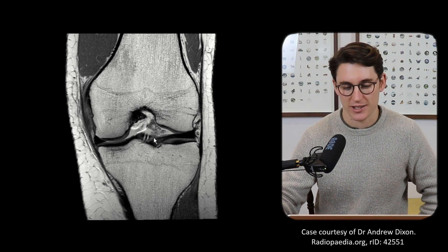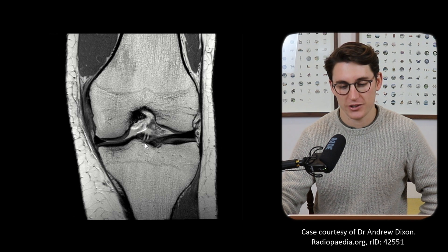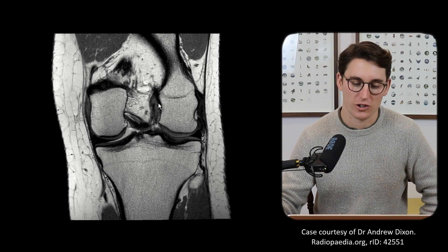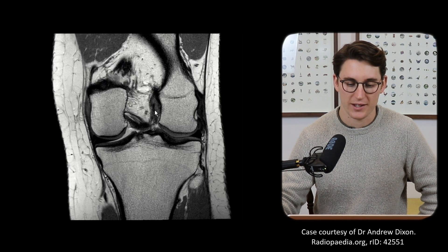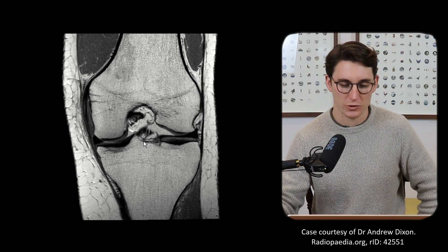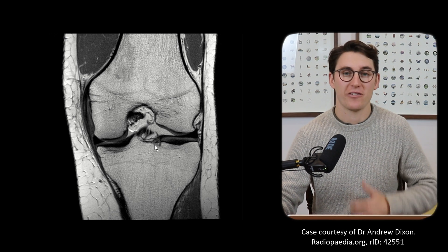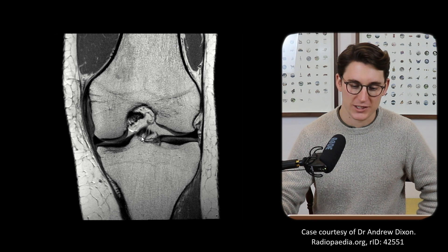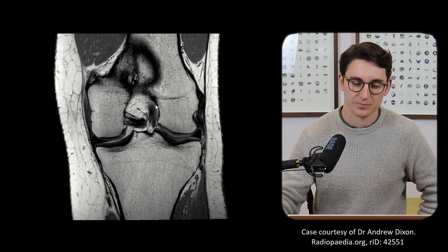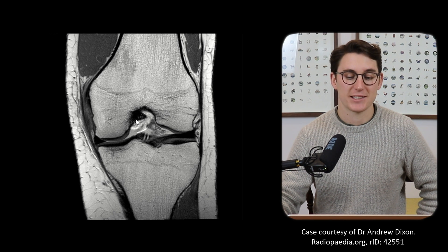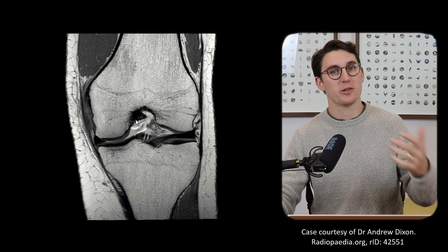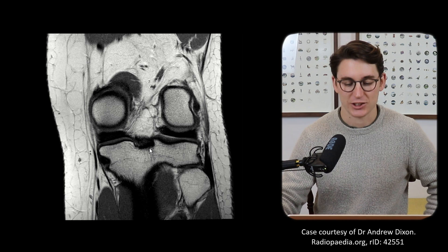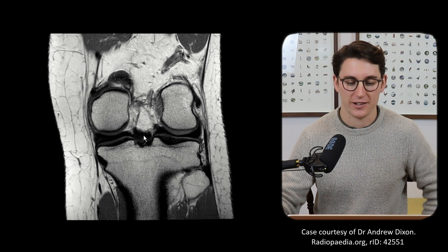Let's head into the joint itself. We can see a ligament coming from the anterior tibia, heading all the way backwards and attaching to the medial surface of our lateral femoral condyle — this is our anterior cruciate ligament. Following it all the way through, we can see some heterogeneous signal within this ligament, which is normal. There are almost two bands visible: an anterior medial band and a posterior lateral band of our ACL. We need to follow this ligament from its tibial attachment all the way up to the femur. We can also see our PCL — the posterior cruciate ligament — which is called posterior because it attaches to the posterior segment of the tibia. We can follow that ligament back and see it attaching to the posterior tibia, and we're going to see this in both our sagittal and axial planes as well.